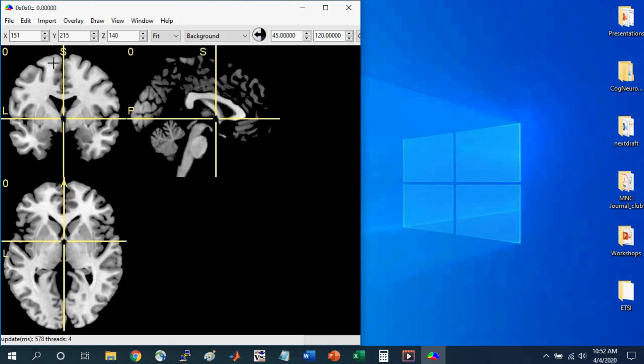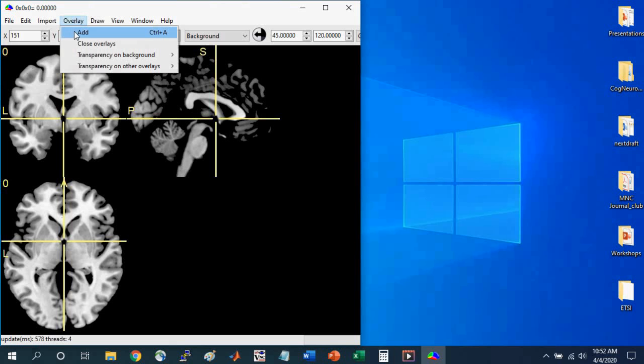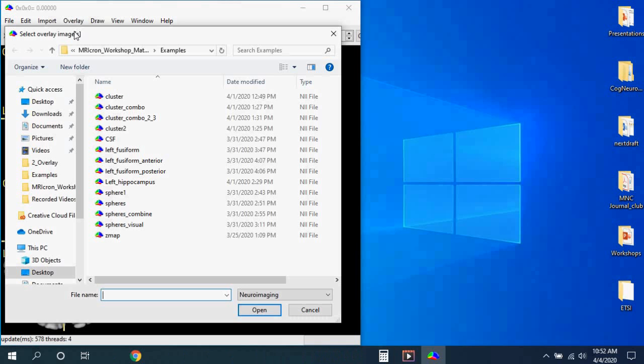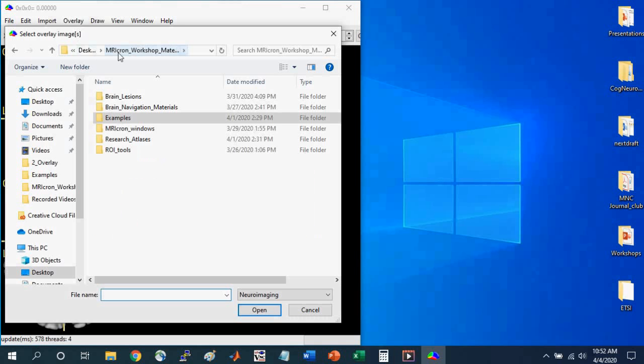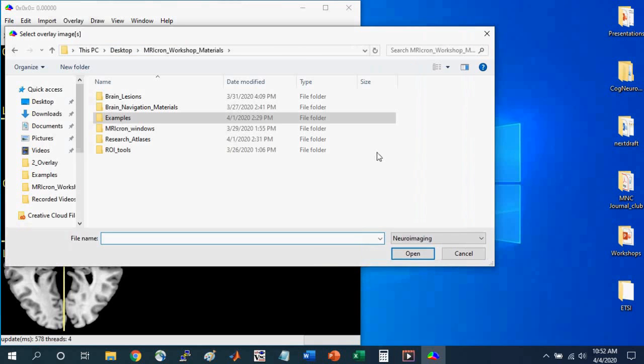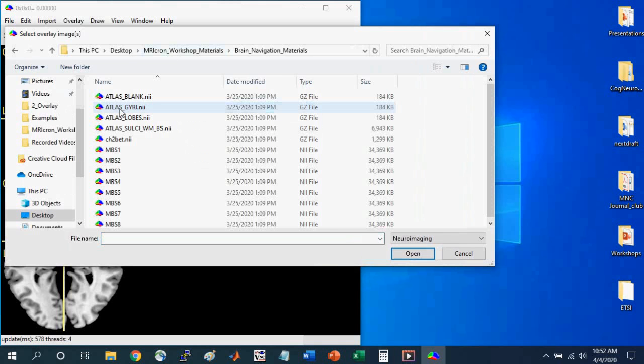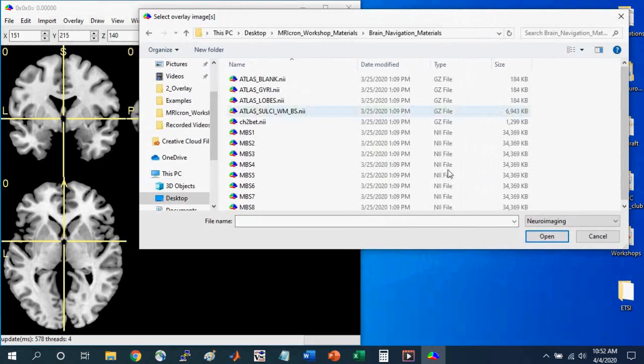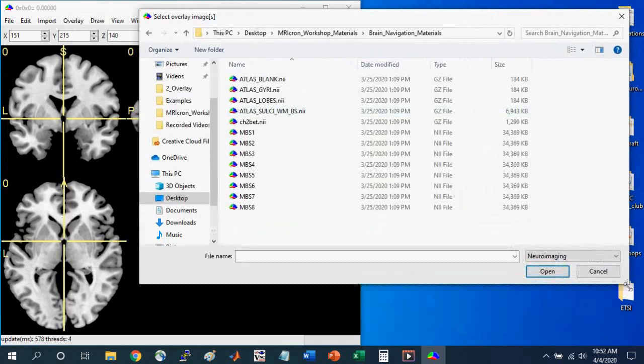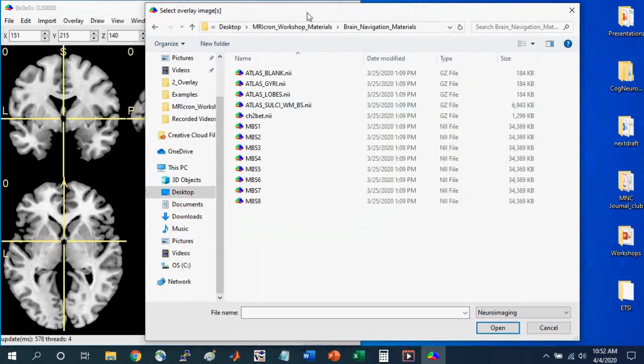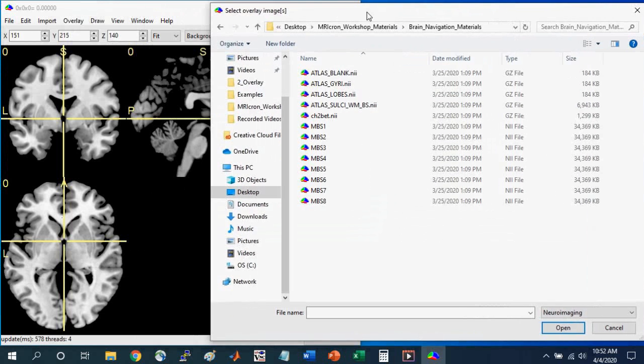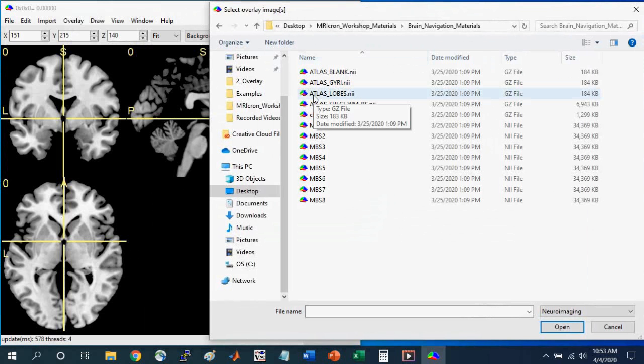The first thing I'm going to do is open up an overlay and put it on top of this underlying brain that we see here. So I'm going to go to Overlay, Add, and I'm going to navigate within the MRI-Cron Workshop Materials folder into the Brain Navigation Materials folder. And within this folder, there's some materials that my colleagues and I developed for a cognitive neuroscience course. These can be used for any course for which you need to learn neuroanatomy. So open Atlas Lobes.